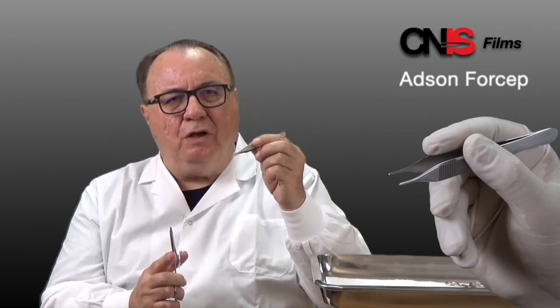This is the Watson forcep. It's either non-toothed for soft tissue or toothed for skin.